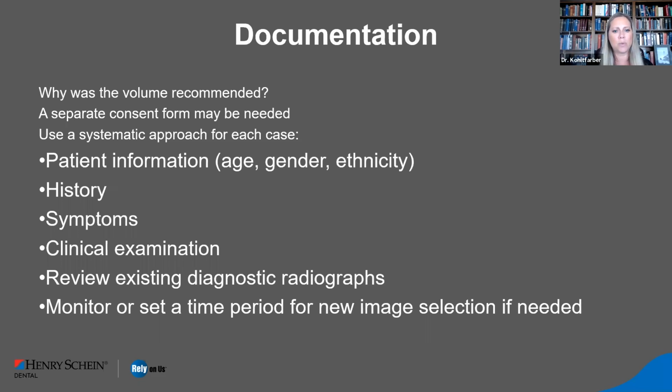And then we use a systematic approach for evaluating each case. And I know I've talked about this before, but we're going to kind of quickly reiterate it. We want to talk about patient information, give a brief history, symptoms, talk about any clinical examinations, review existing dental radiographs. So you're looking back, is whatever you're concerned about getting larger? Is it staying the same size? Or monitor. Maybe we want to monitor something. Maybe we want to reevaluate in 3 to 6 months and see if there's a growth potential that would require a biopsy. So kind of some documentation.